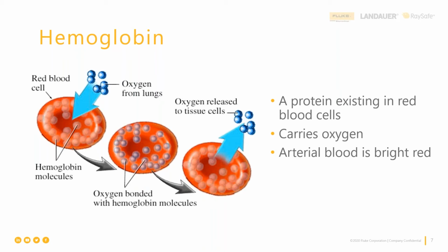Now, what we're focusing on here is pulse oximetry, but there is also a technology called pulse co-oximetry. And Jerry, do you want to put some color on that? Yeah, so as I said, sometimes these hemoglobin molecules get filled with something else, and that something else is typically carbon monoxide. That's a poison to the body. So unfortunately, pulse oximetry is using just 2 wavelengths of light, and we'll get into the details about that a little bit later. Whereas the pulsed co-oximetry is using 8 or more wavelengths of light so that it can actually identify the difference between what is oxygen and what is carbon monoxide.